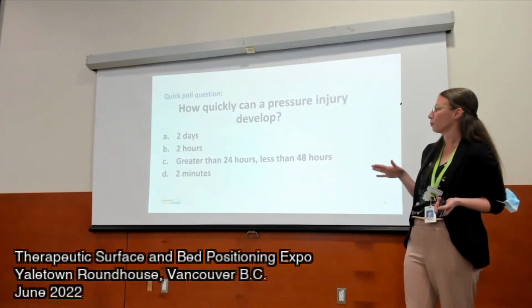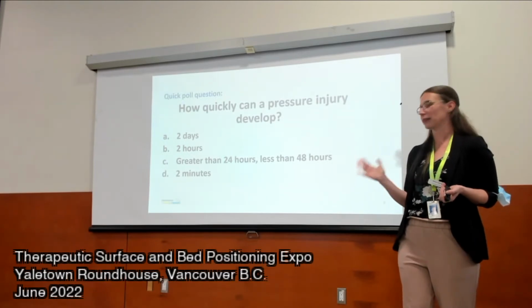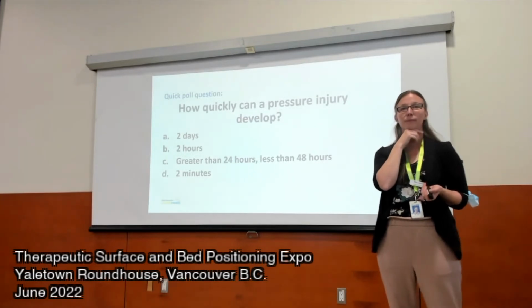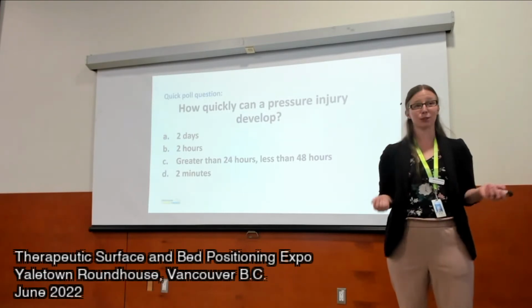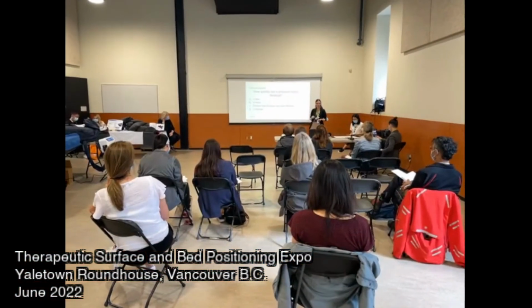So how quickly can a pressure injury develop? 2 days, 2 hours, greater than 24 but less than 48, or 2 minutes? 2 hours, exactly. So when we think about our repositioning schedules, that's why there are 2 hours. Because that's how long it takes to develop.